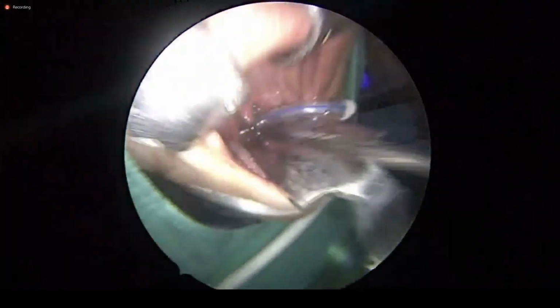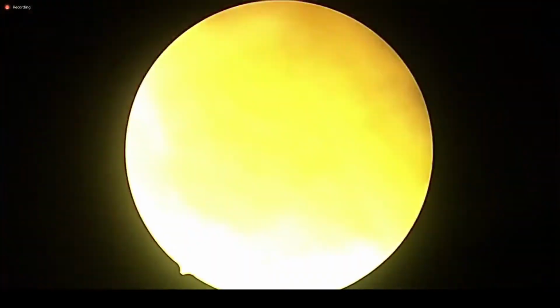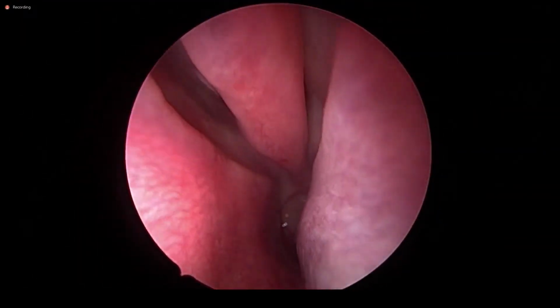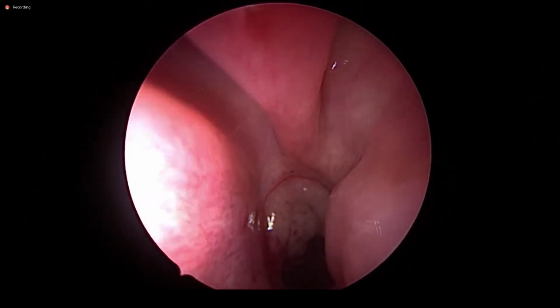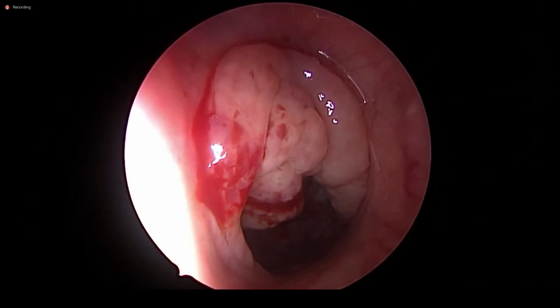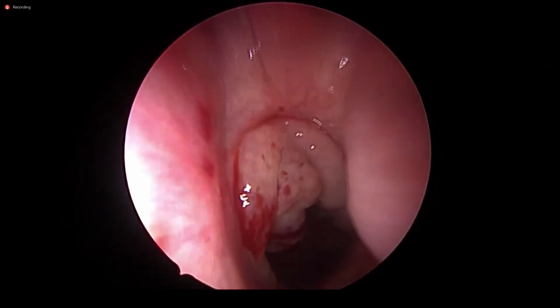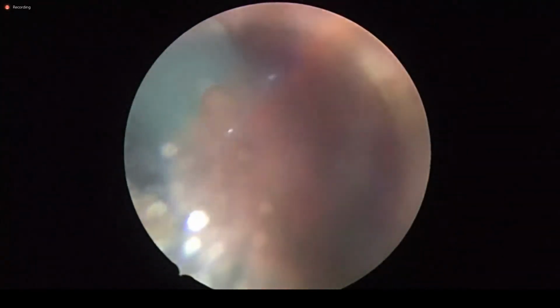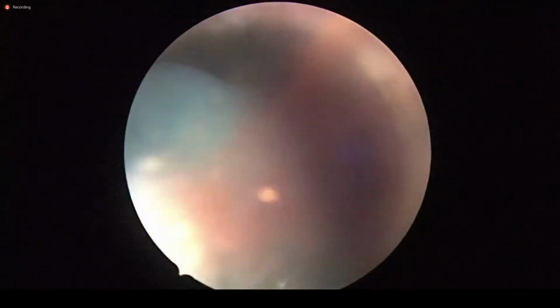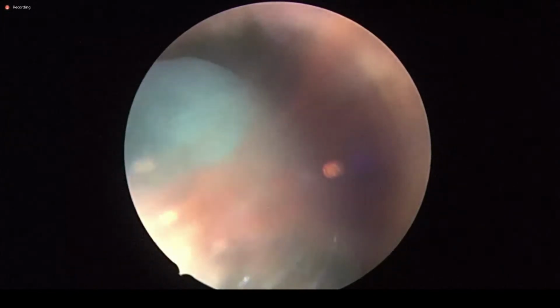Because my second phase would be removal of the adenoids completely from the posterior nasopharyngeal wall musculature, in the fascia plane covering the muscles behind. That is very, very important. I need to preserve that fascia to protect the muscles behind. In order to remove the adenoid, if I happen to damage the musculature behind, complications are invited.